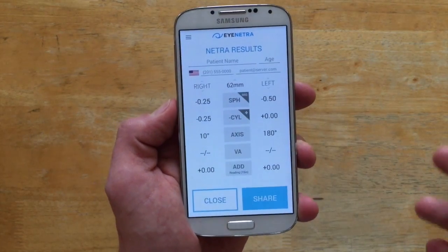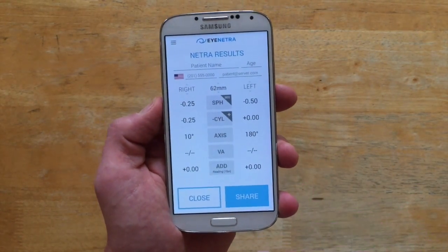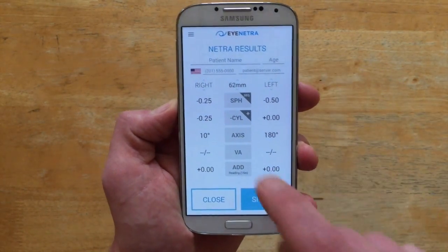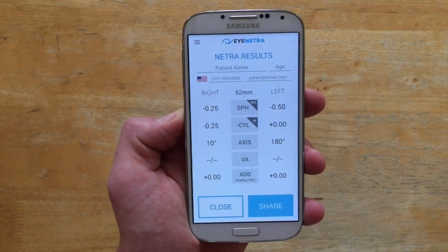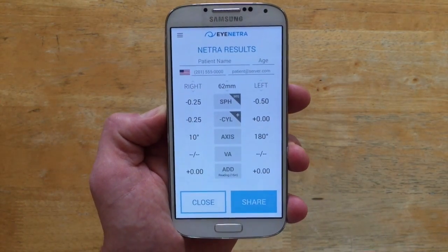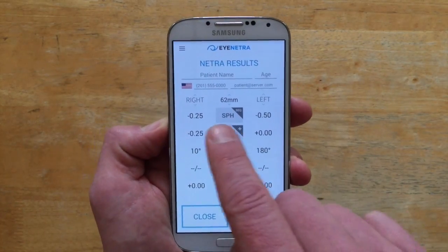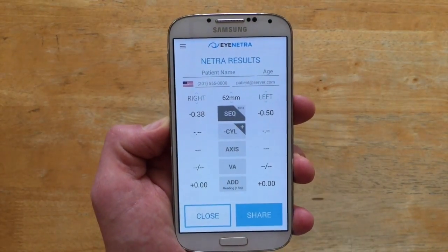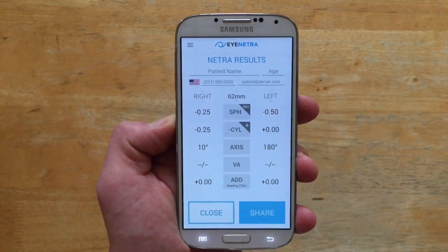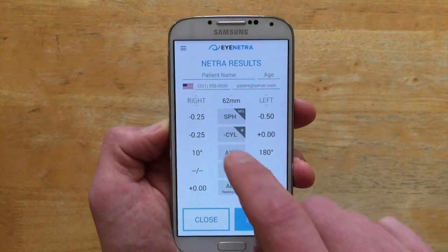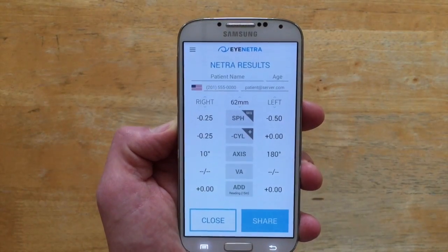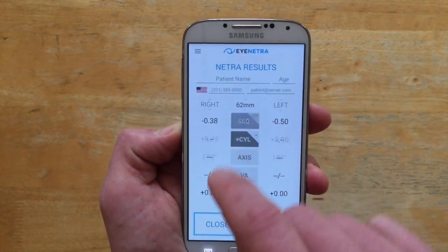I've just completed a Netra refraction and what we see on the screen is the refractive powers for both the right eye and the left eye, with PD data in the center as well. By default this comes out in standard sphero-cylindrical notation, but if you prefer spherical equivalent you can tap the sphere icon to convert, and tap again to go right back. Same thing with plus cylinder — tap the cyl icon to get to plus cyl and back. You can use these to easily toggle back and forth.